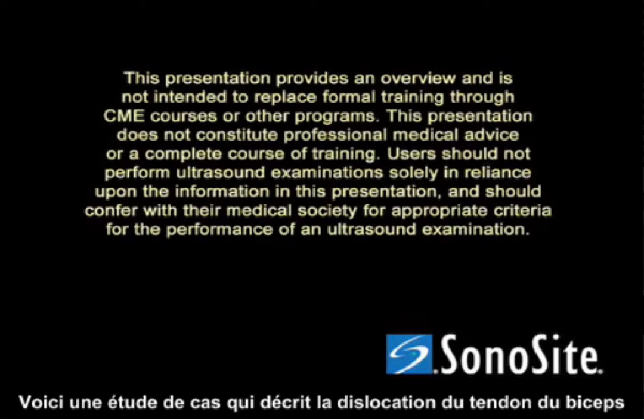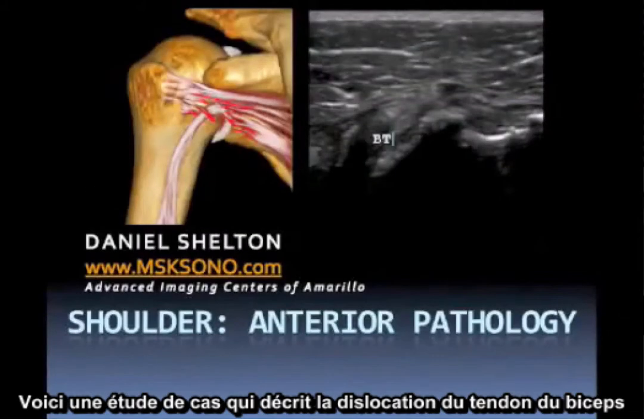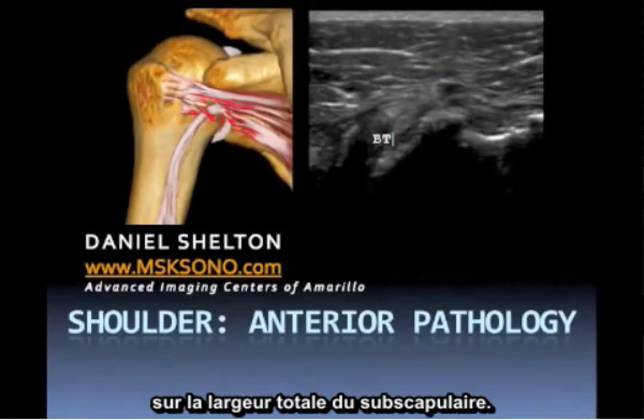This is a case study describing a dislocation of the bicep tendon as well as a full thickness tear of the subscapularis.